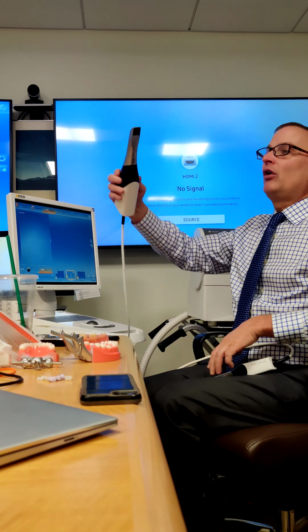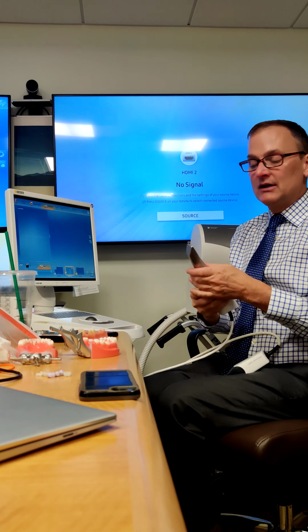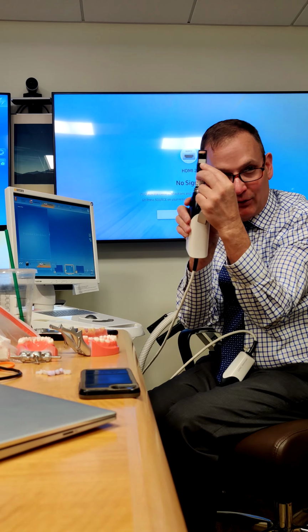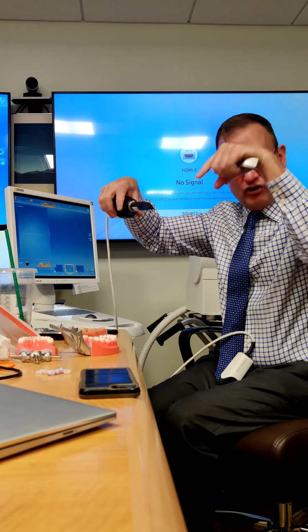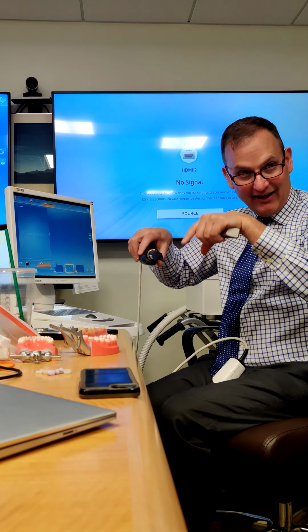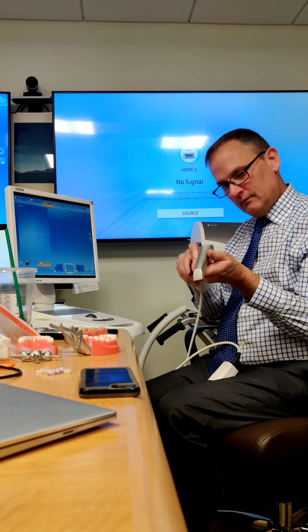So that's why it's very important to watch what you're capturing up here, because it's not down. Now you're like, well, Dr. Douglas, this is the same. It's thicker, it's bigger, but it's the same angle, and it's got a mirror in there. See the mirror in there? That's not the scanner. This in here is not the scanner. This little tiny thing right there, that piece of tape, that's the scanner. So the scanner's scanning straight down. Then you're like, well, why is the mirror there and why is the mirror at an angle? That's the light direction. So that's shining the light down easier. So when you scan with Prime Scan, it is scanning straight down.